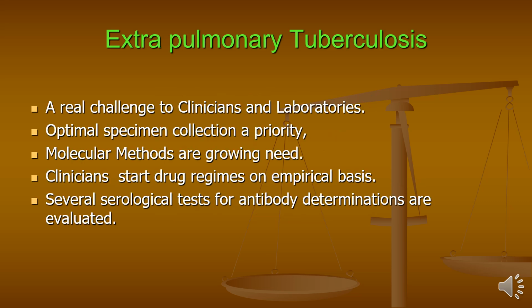So it is a real challenge for clinical people and the laboratories. Optimal specimen collection is a priority. Molecular methods are a growing need. Clinicians should start drug regimens on an empirical basis. Several serological tests for antibody determination are available.